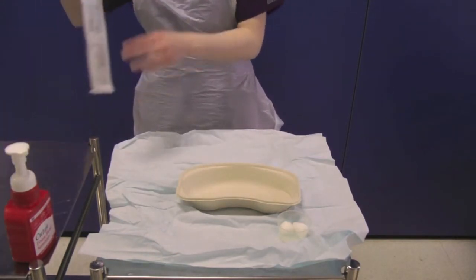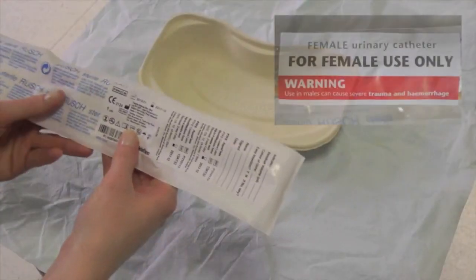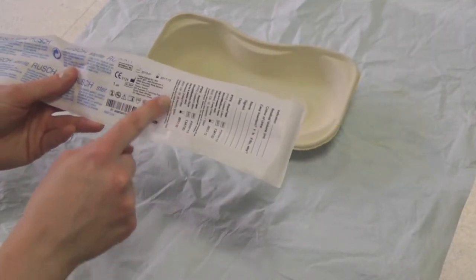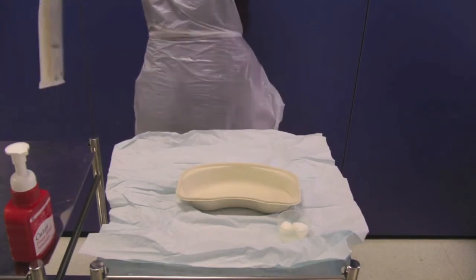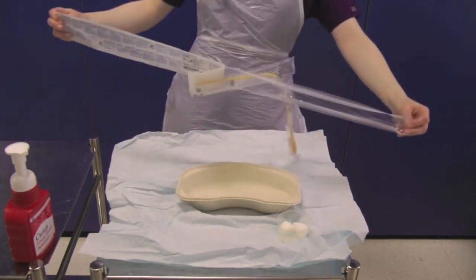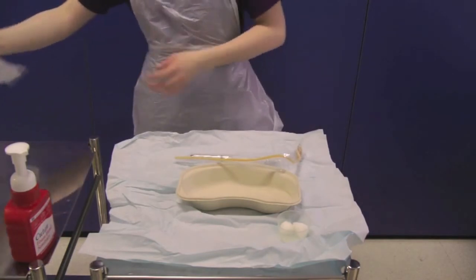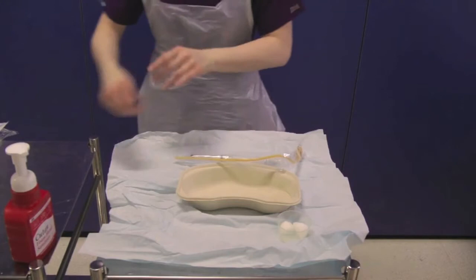Take the selected catheter, ensuring you have the correct size. A female catheter should never be used in a male patient. Check the expiry date and note the stickers on the catheter pack that must be saved for use in the notes later. Open the outer packaging and carefully drop the catheter and syringe onto the sterile field. Be very careful not to touch the sterile field with the non-sterile outer catheter packaging.